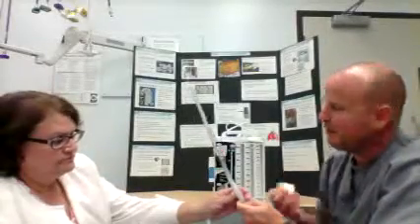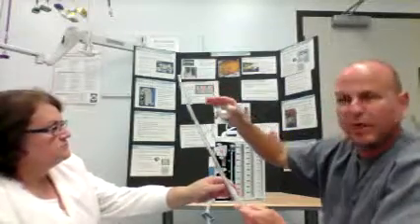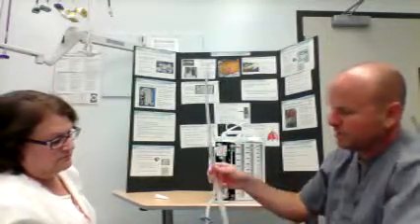When we hook it up, let's just pretend that this tube is in a patient. The doctor will slide this in here, and hopefully he will put it nice and secure. Now, a lot of times the doc will say, all right, it's all yours now. Of course, he will dress this area up against it. He'll suture it in, and he'll dress this area with an occlusive dressing, and he'll handle this end at the dressing side. Here where we connect, it's very important that this connection doesn't come undone.